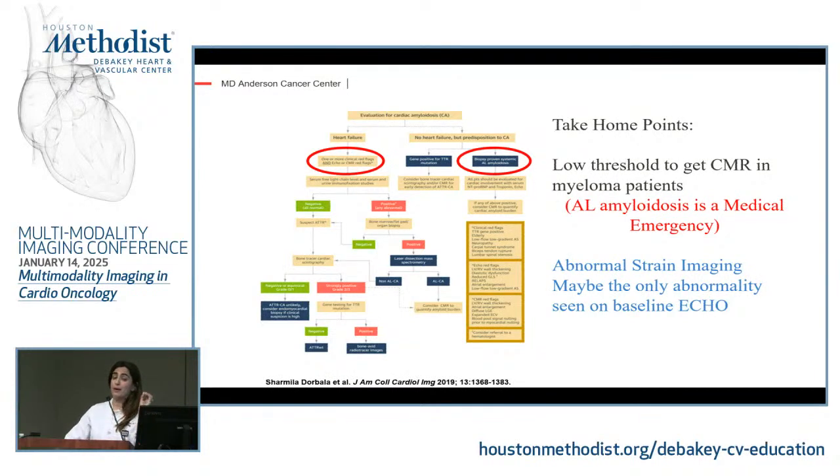So am I saying every single myeloma patient needs a CMR? Not yet, but we might get to that point where the patients with high features of myeloma might start getting referred for CMR. So my practice is skyrocketing right now.